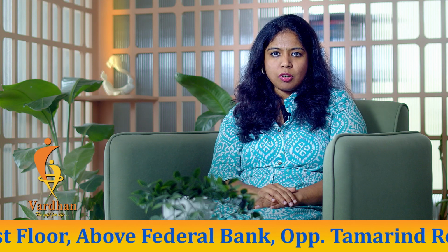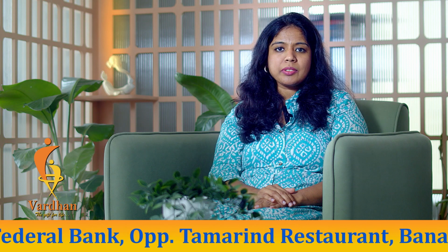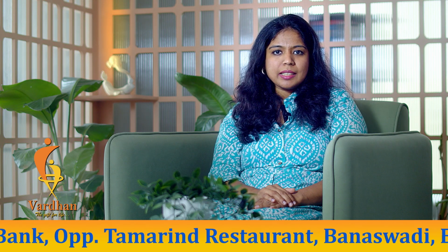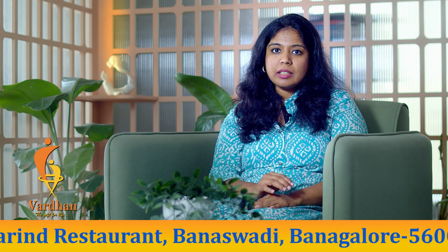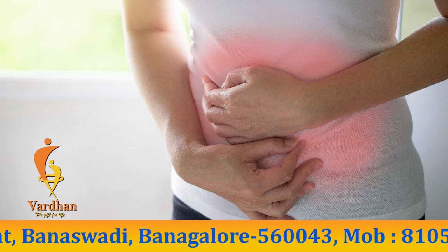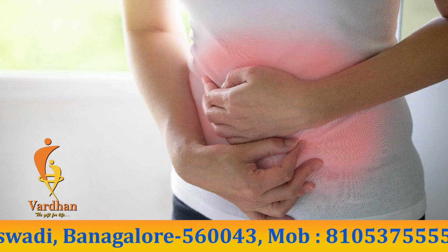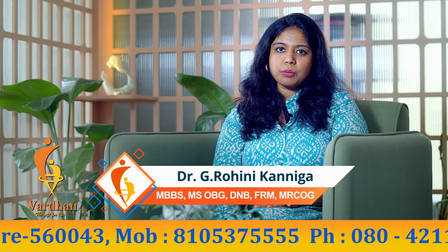And there are some minor complications that can happen. The patient may experience some pain, abdominal cramps, bleeding, and there are some serious complications, like chances of infection. There may also be chances of injury to the uterus, but these complications are quite rare, maybe seen in 1 in thousands of women. So this is what you can anticipate when you are undergoing diagnostic hysteroscopy.